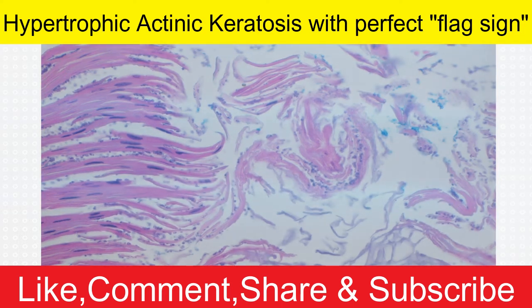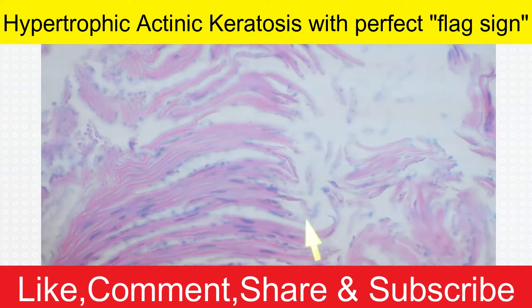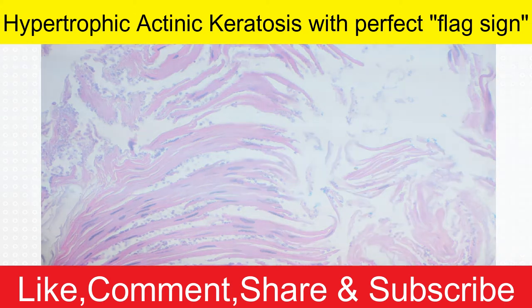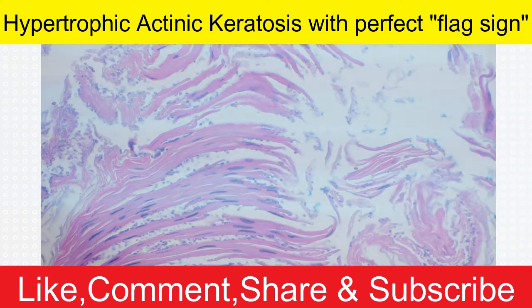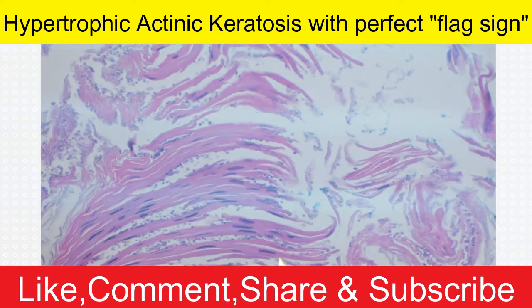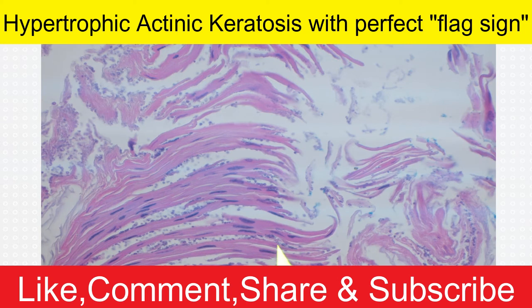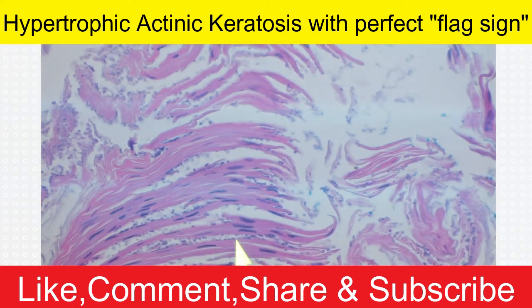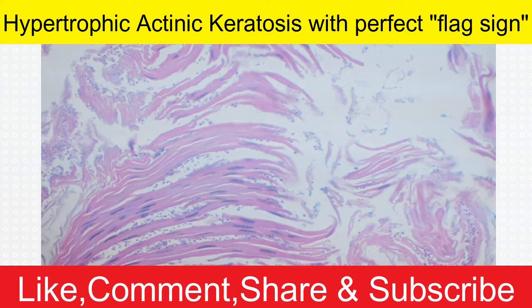And the other thing I was going to mention in here is that in addition to yeast, look at these much, much smaller little dots. You can see that there's some really tiny dots that are much smaller than the yeast, and those are bacteria. So both yeast and bacteria are round, but once you see them side by side, the size difference is dramatic. These little tiny ones, I'm trying to get the arrow without knocking, those are bacteria, and then next to them you can see those are yeast. So look, the yeast are like 5 or 10 times bigger. They're much, much bigger than the bacteria. So when you see them back to back, it's easy to notice them.